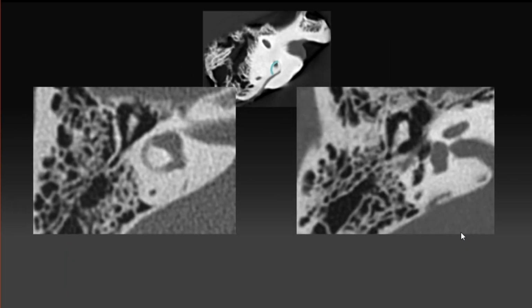So now you can see this patient on the right of the screen has that normal trajectory, right? So the stick that is getting held onto by hands is kind of side to side. On the left, you can see that that part is kind of front to back. And that is the fetal orientation. And you can imagine now the angle, the ATVA, is no longer close to 90. It's closer to 180 degrees.